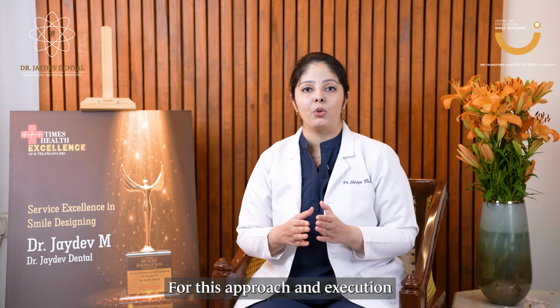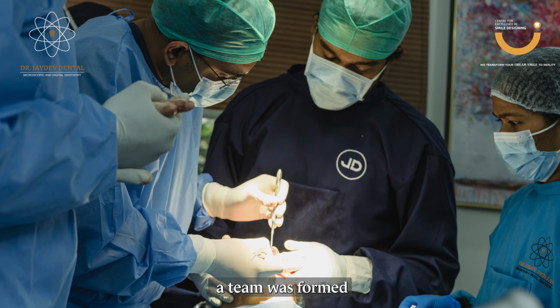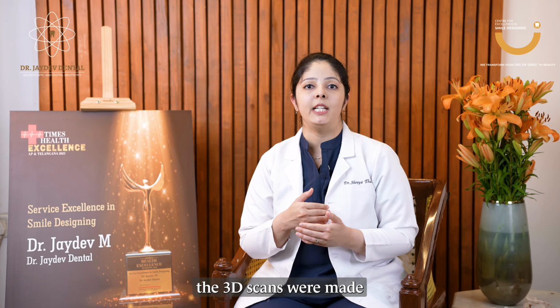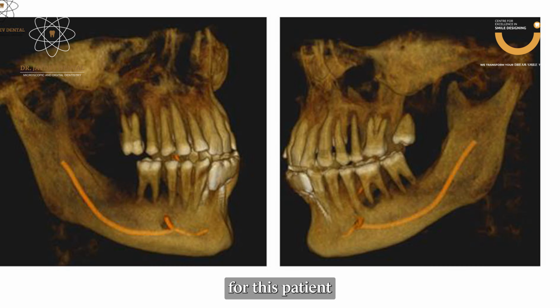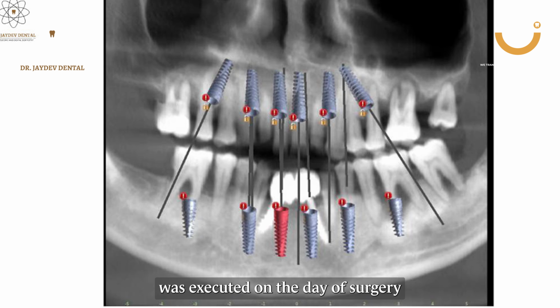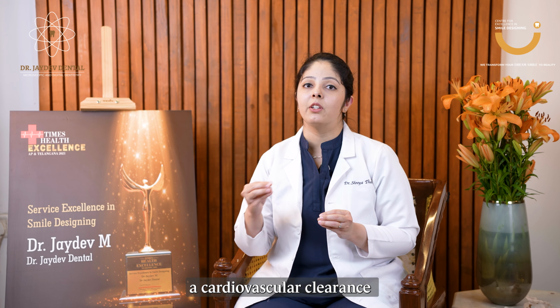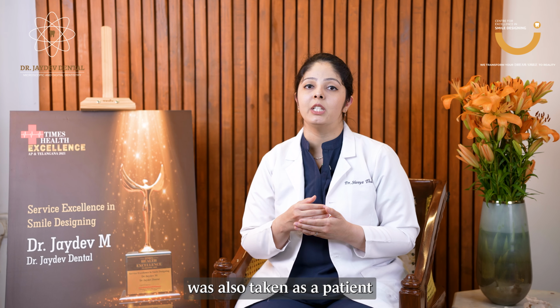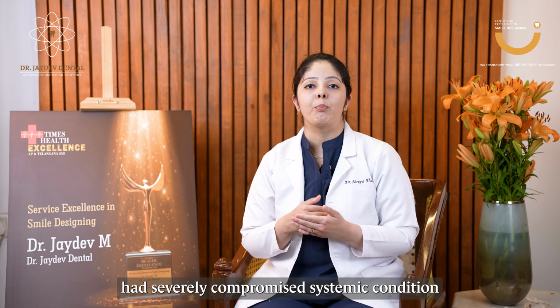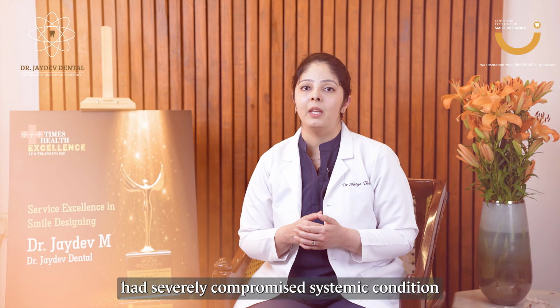For this approach and execution, a team was formed. All of them with a combined effort executed this case. Once the patient came in, the 3D scans were made, the 3D digital guide was made for this patient, and then the surgery was executed on the day of surgery. Not to mention, a cardiovascular clearance from his cardiologist was also taken, as the patient had a severely compromised systemic condition.